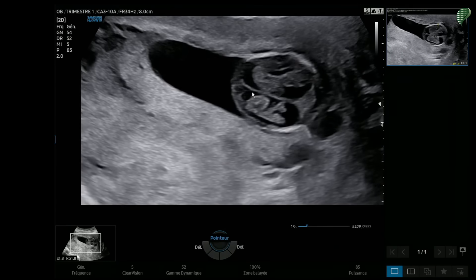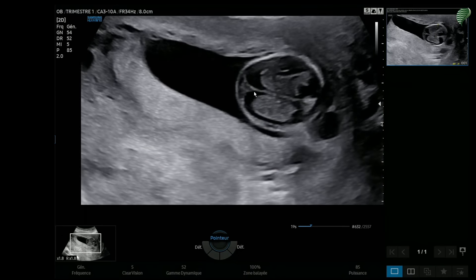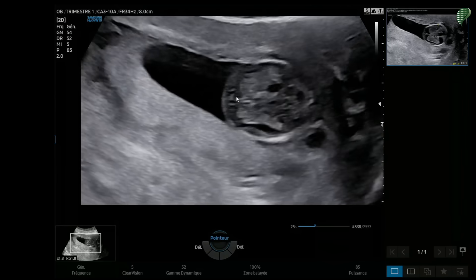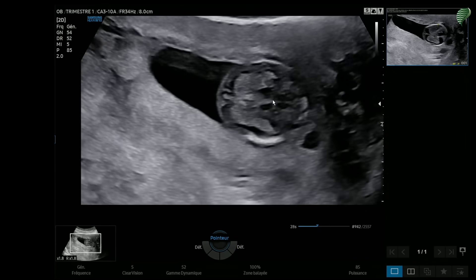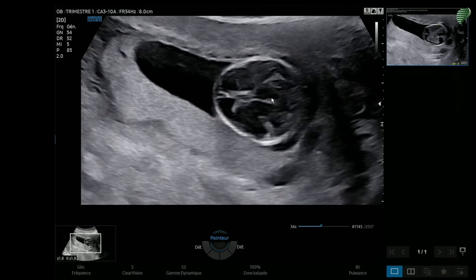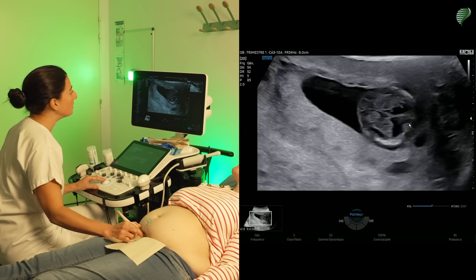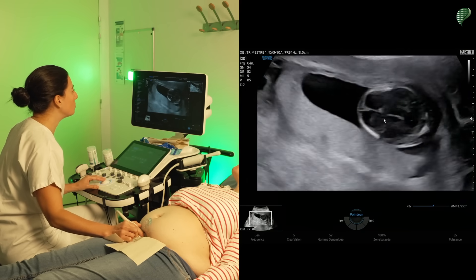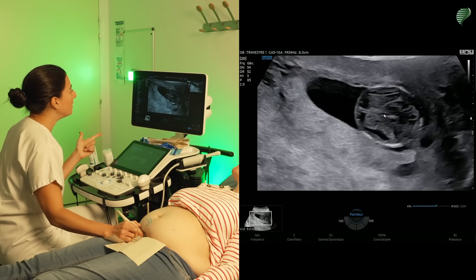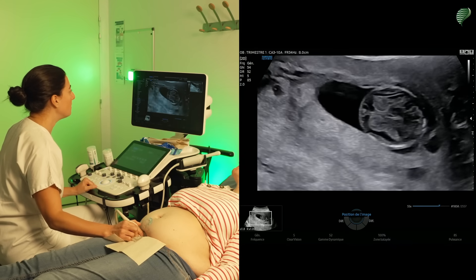I check the midline to rule out the diagnosis of holoprosencephaly, since holoprosencephaly creates a single cavity in its alobar form. Here I can see a midline with a good separation between the two hemispheres. I see the choroid plexuses on each side and the thalami in the middle. The posterior fossa can't easily be examined in the first trimester, so I advise not to delve into it. We already have the three important elements: the contours of the skull, the biparietal diameter, and the midline.